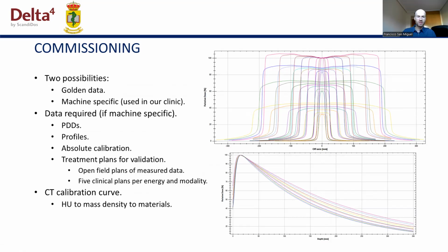It is important to remark that multiple isocenters in the same plan are not yet supported.